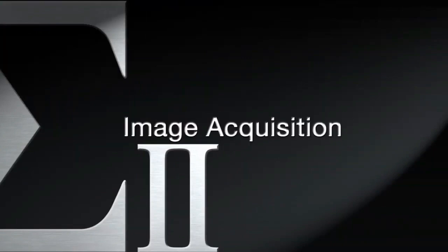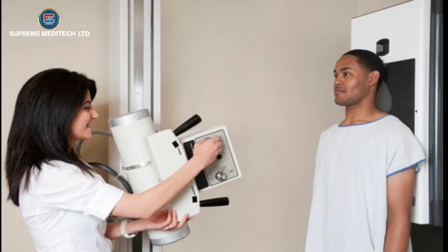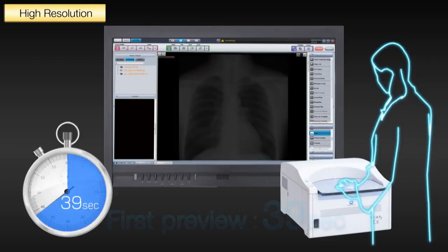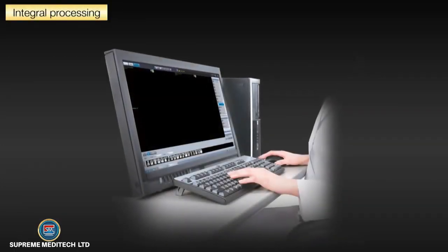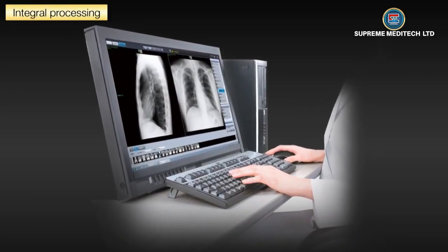Image Acquisition: Open the registered patient to the view screen, click on the CR button, and perform your x-ray exam with your normal exposure techniques. Insert the exposed cassette into the Regis Sigma reader. The ImagePilot then uses the integral processing software to automatically optimize the image display.